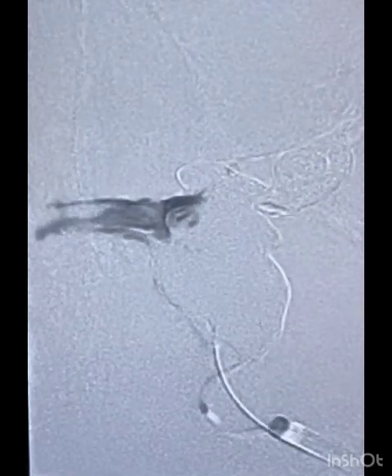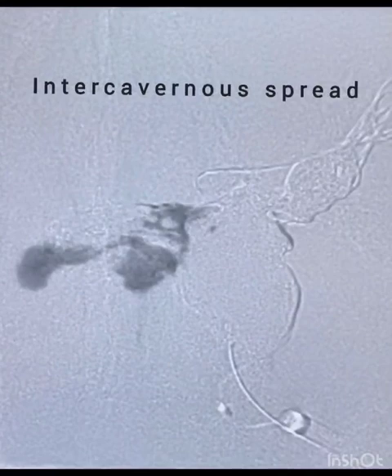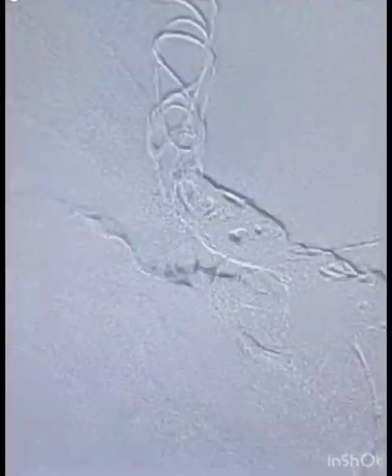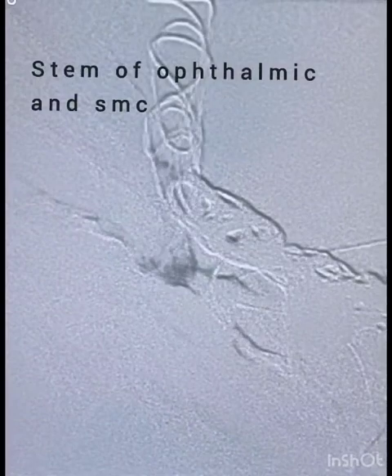Thereafter, Onyx was injected from the microcatheter that was across the rent site with balloon inflation. Note spread of Onyx into the contralateral side through the intercavernous connections. With further injection, you note that there is further spread into the intercavernous sinus into the contralateral segment.